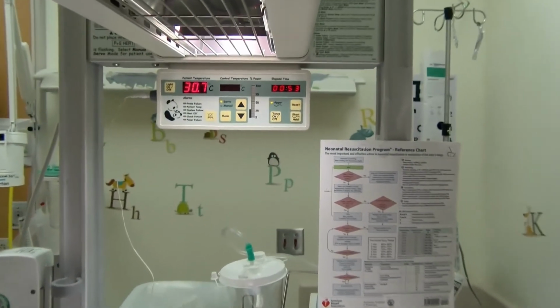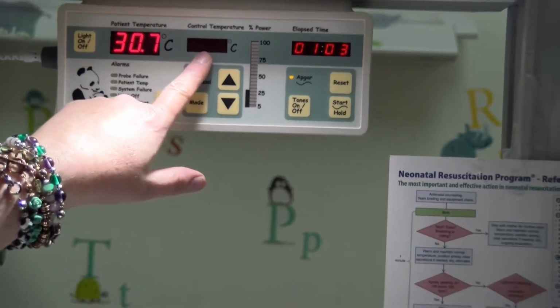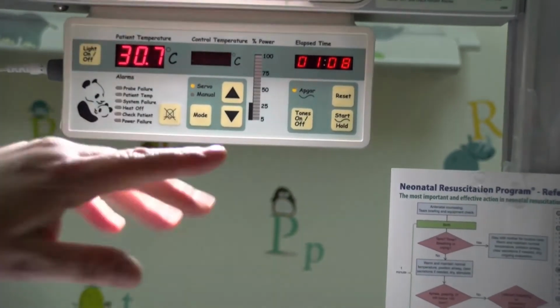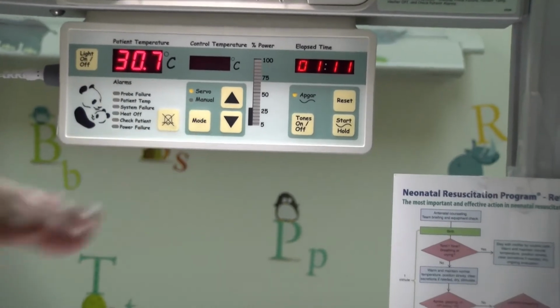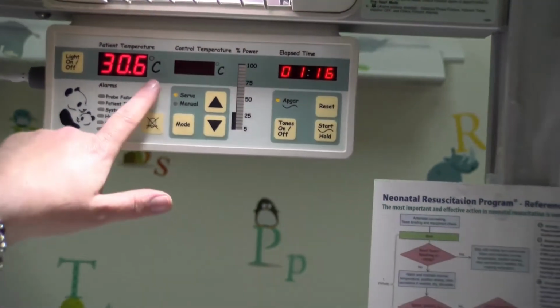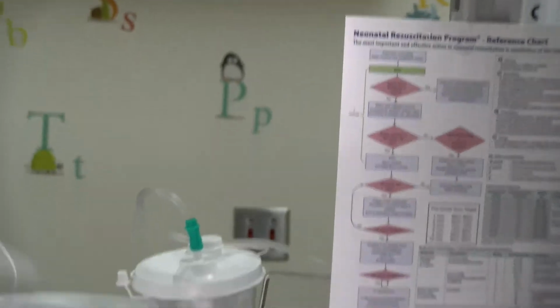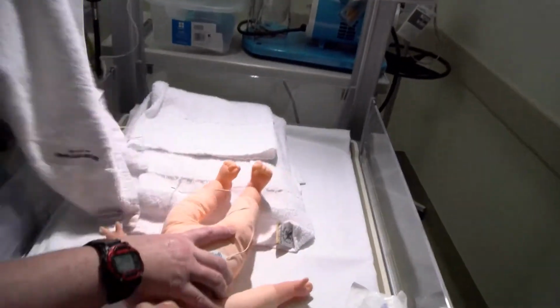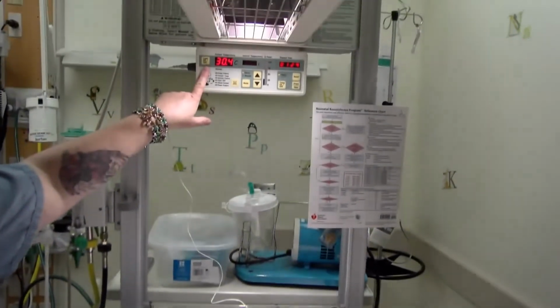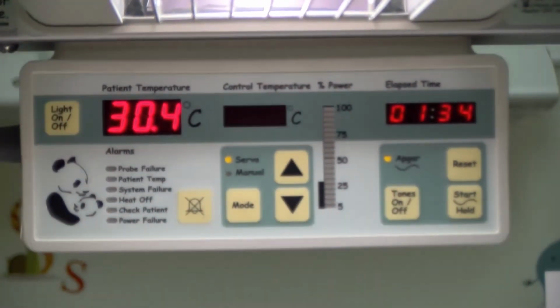What servo will do is it's going to read the temperature, and this is the goal temperature to keep the baby warmed up. The servo is going to read the patient's temperature, and it's going to start adjusting the heat of the Panda Warmer for the patient to get the patient's heat up to 36.5 degrees Celsius. As you can hear, the warmer is going off because the patient's temperature is extremely low. So I'm just going to hit silence right now.